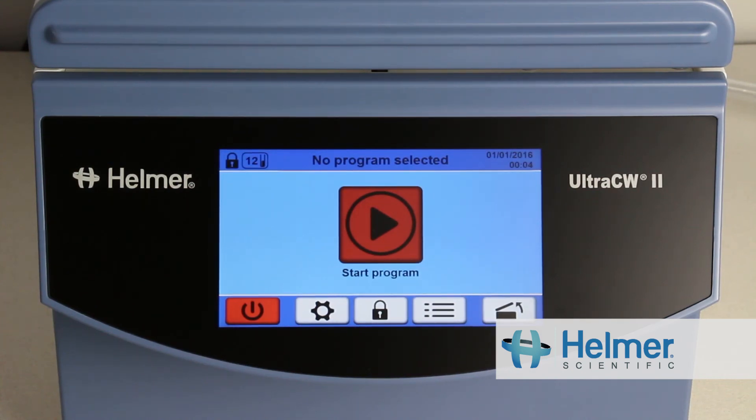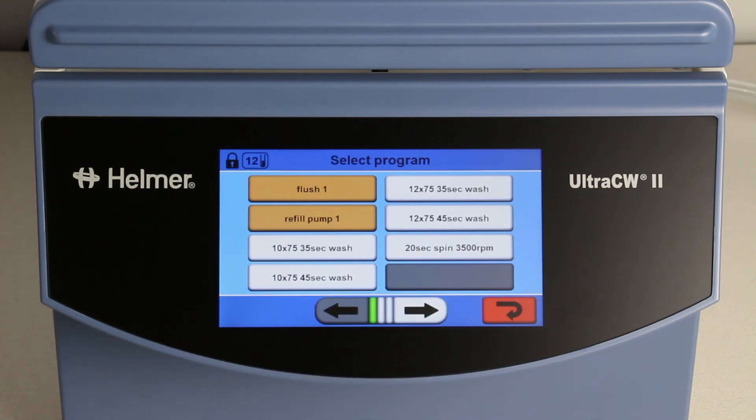This video provides a demonstration of the pre-set programs installed on the Ultra CW2 automatic cell washing system from Helmer Scientific.